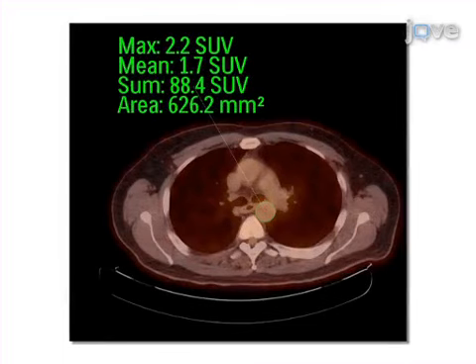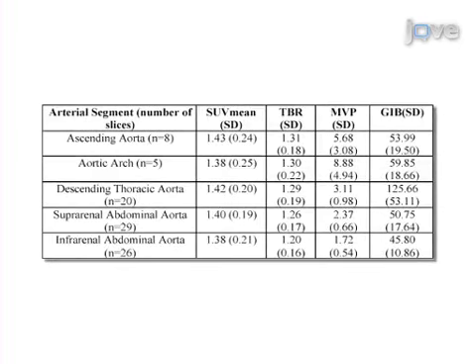Ultimately, the results depict and quantify the burden of atherosclerosis in any given arterial region through the utilization of FDG-PET CT with quantification.